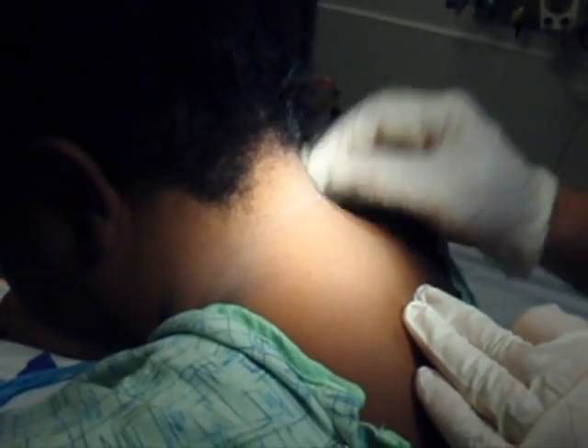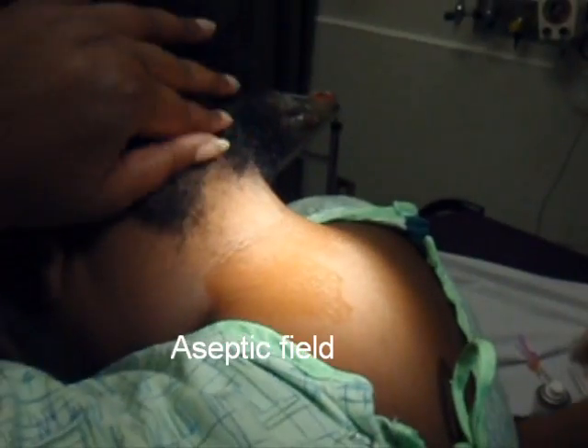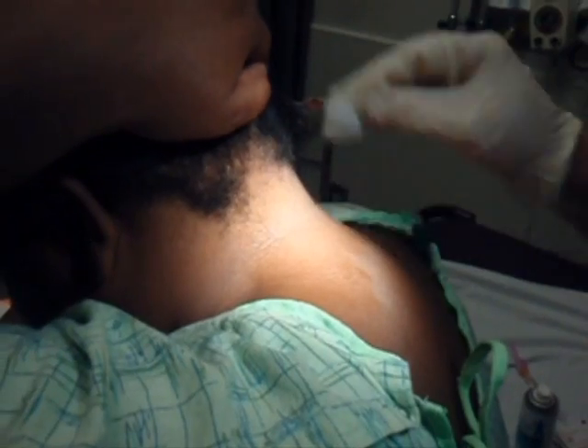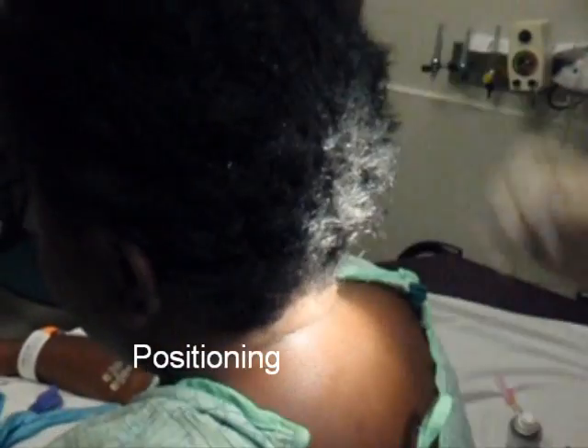All right, so this is doing a cervical injection and I'm going to sterilize the area with an alcohol pad. I'm going to have your head a little more straight than this — position like that. You can put your hand down, you're okay in that regard.